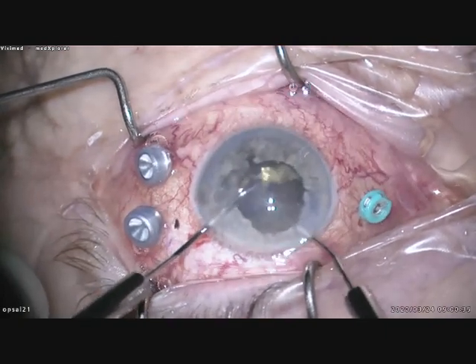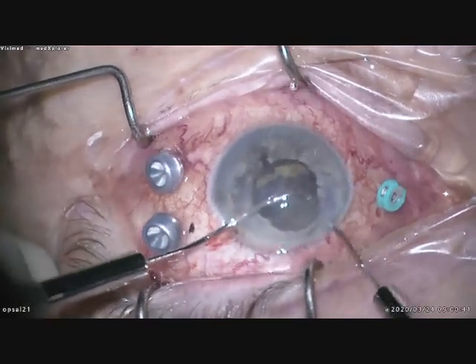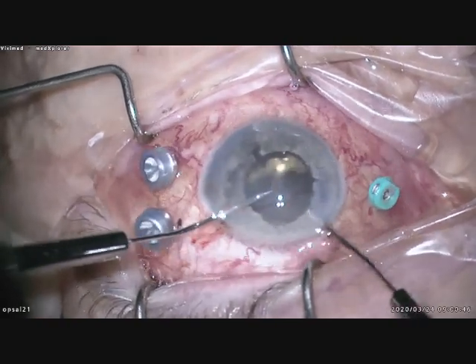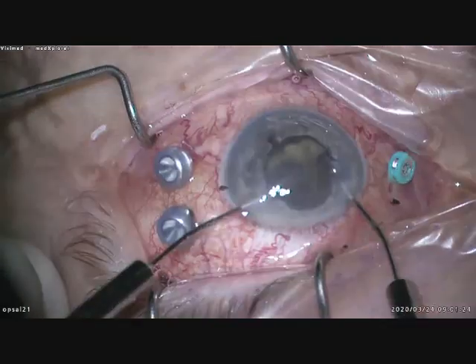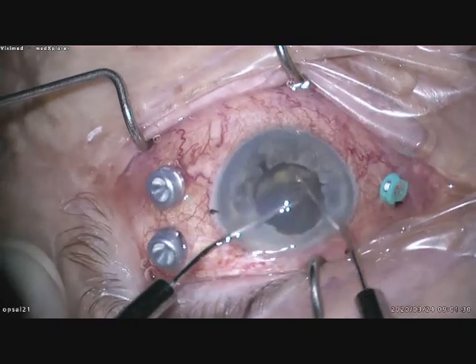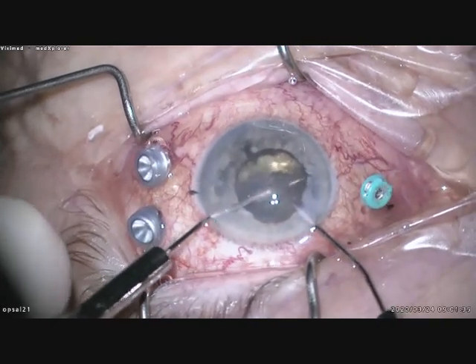This is a very unusual finding after a vitrectomy for ophthalmitis. The bacterium was Streptococcus agalactiae, which is Group B Streptococci. It was one day after injection that the ophthalmitis occurred with a very strong inflammatory reaction.